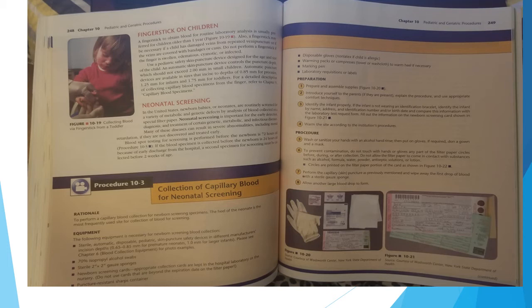An automatic skin puncture device controls the puncture depth, which should not exceed 2 millimeters in small children. Automatic puncture devices are available in sizes that incise depths of 0.85 millimeters for preemies, 1.25 millimeters for infants, and 1.75 millimeters for toddlers. For a detailed description of collecting capillary blood specimens from the finger, refer to Chapter 9, Capillary Blood Specimens.